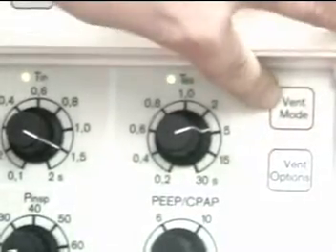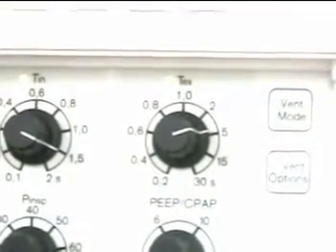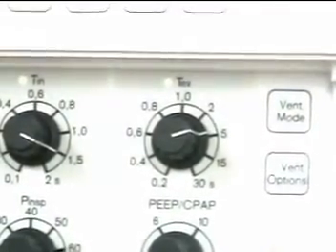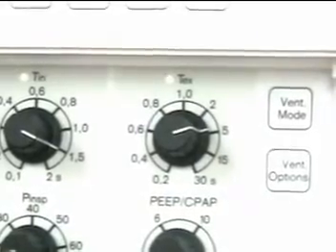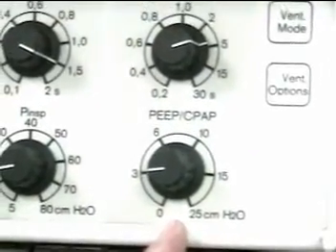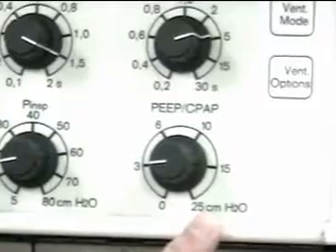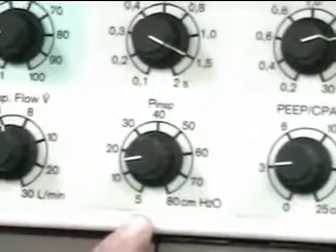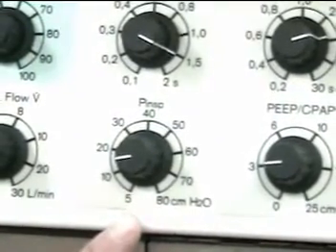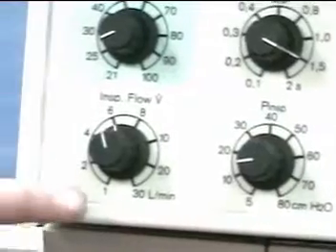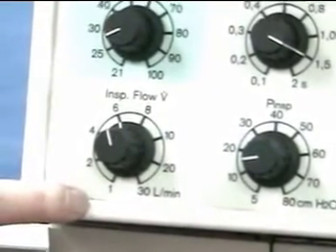The dial over here is the ventilator modes button. Below it is ventilator options. Down at the bottom is the PEEP CPAP value in centimeters of water pressure. Next to it is peak inspiratory pressure, and off to the left at the bottom is inspiratory flow in liters per minute.